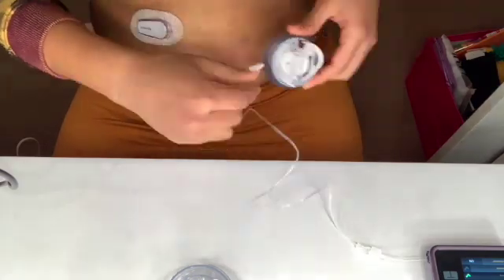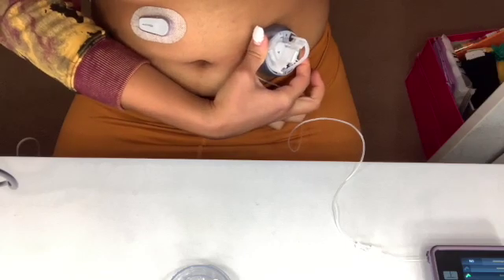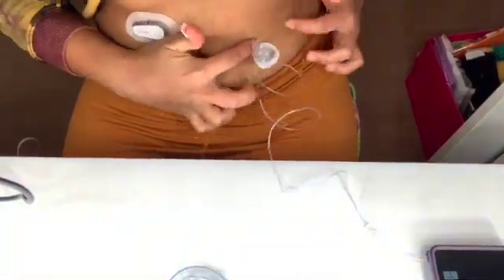So now I'm making sure the tubing is out of the way, and I'm gonna put it in the new spot. And then you just click the, there's 2 side knobs for your thumbs and your fingers, and you're just gonna click that, and then there it is. And now just press down the sticky part, make sure it sticks.